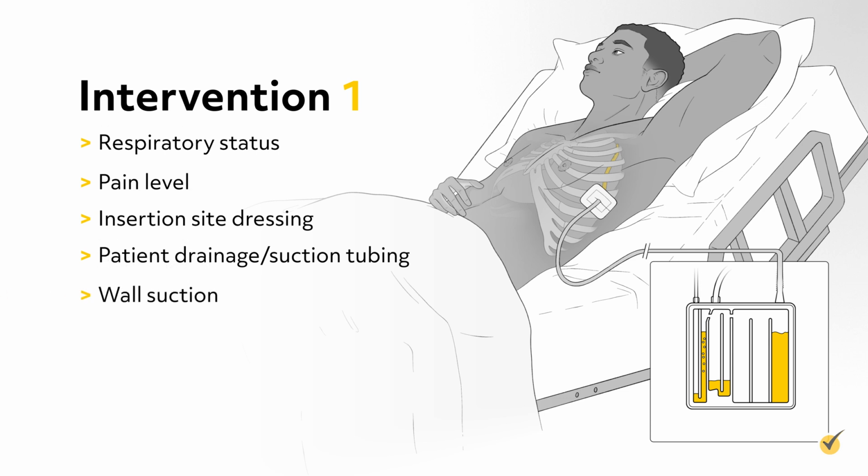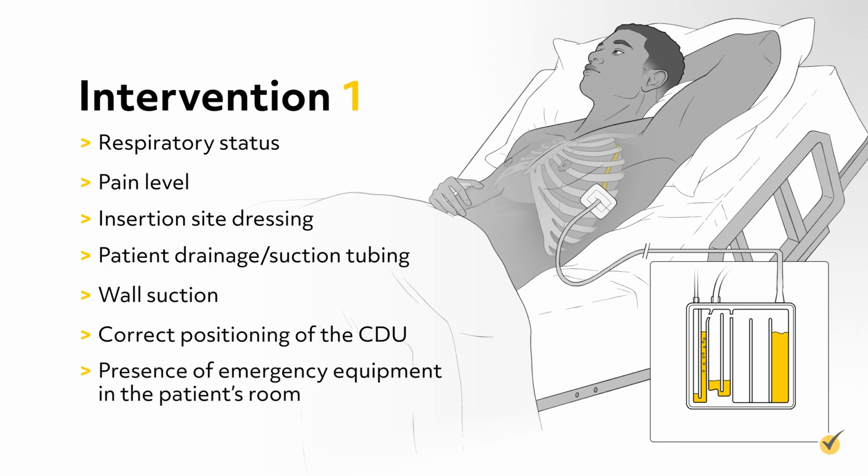Wall suction, which is generally set at 80 to 120 millimeters of mercury, correct positioning of the CDU, and the presence of emergency equipment in the patient's room.